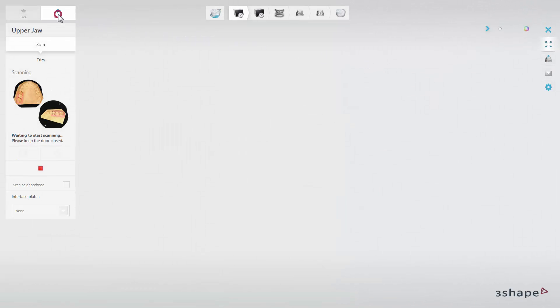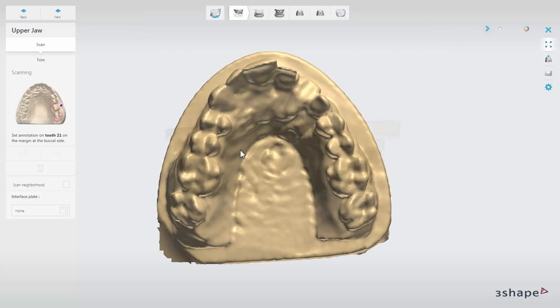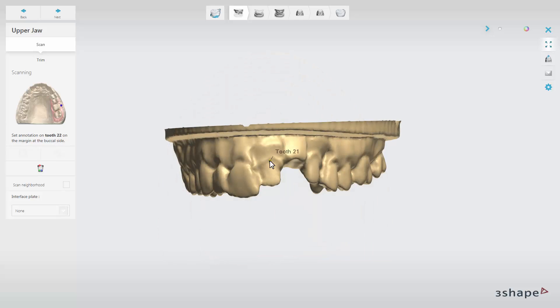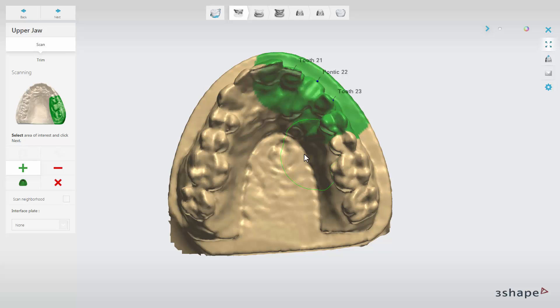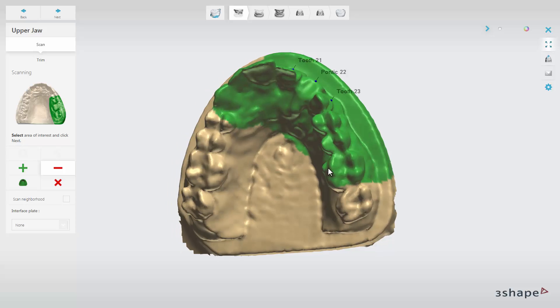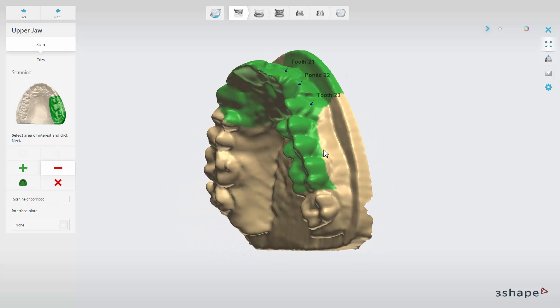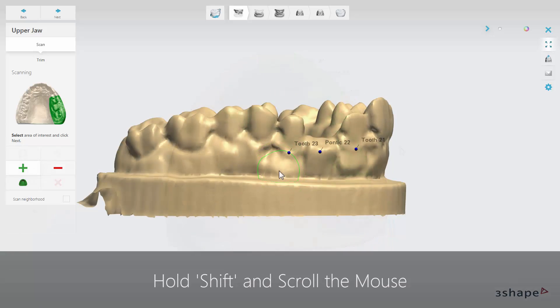When you start the scanning process, the scanner first makes initial scans of the upper and lower jaw. During the initial scan of the Preparation Arch, set the annotation points. Now you can add or remove a desired scan area on the pre-scan model. You can do this just by pointing at it and clicking. The radius of the tool can be changed by holding Shift and scrolling the mouse.